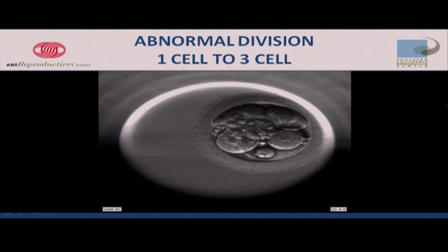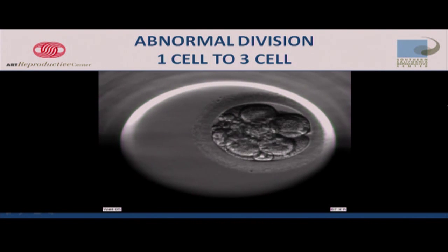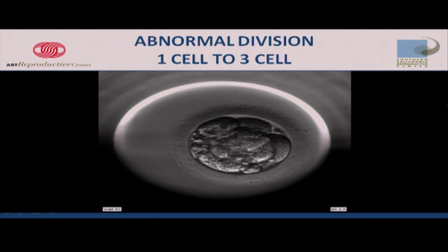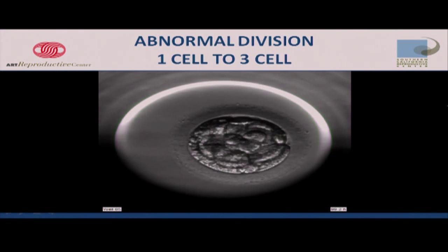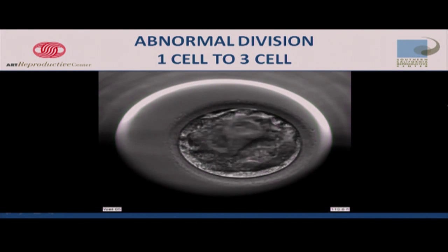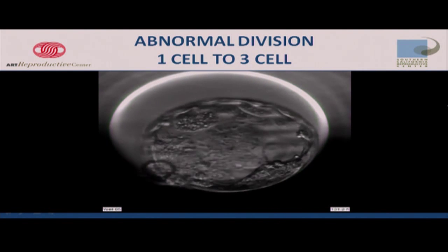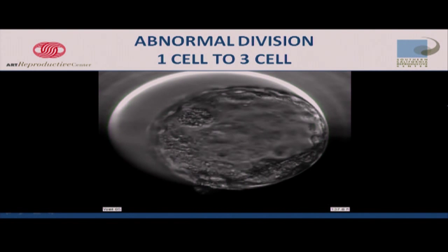But we watch it, and we let it continue. We saw something bad, but we continue, and we continue, and we actually see that it still does form a blastocyst when you go all the way out. Now, if you only look at very specific time points, like Denny talked about, those static observations, you would see a blastocyst at the end that's hatching out and that actually does have an inner cell mass. Not the most beautiful one, but it's got one. And it would be in your possible transfer pool.